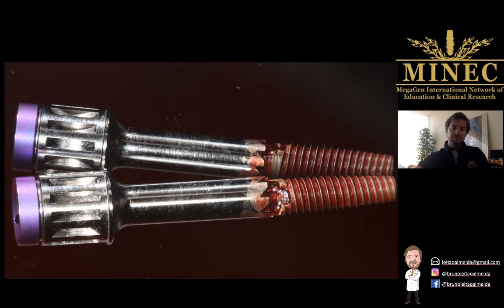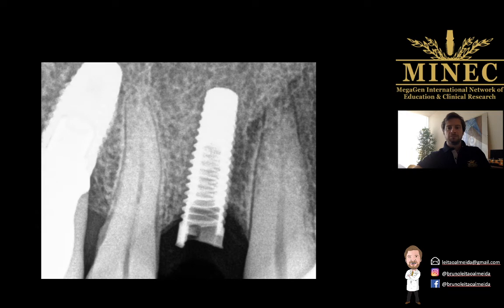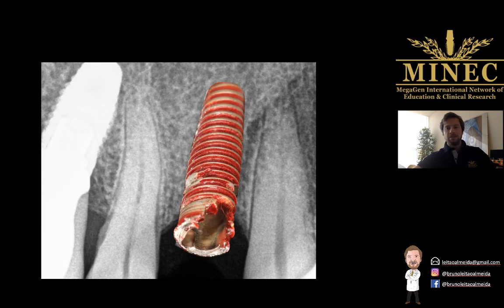You see here a detailed picture of the implant removed, you can see perfectly where the platform was broken and the implant wall was broken, and you can see how this fixture removal engages the implant and makes it go counterclockwise and turn. We can see here the marginal bone loss that usually goes up to the level where the fracture is. It reminds me of a broken tooth with a vertical fracture. It's exactly the same what happens. And you can see the implant after removal.